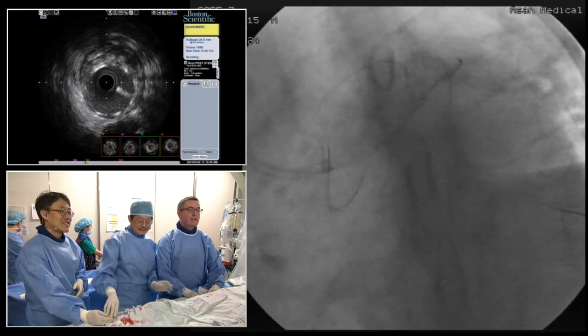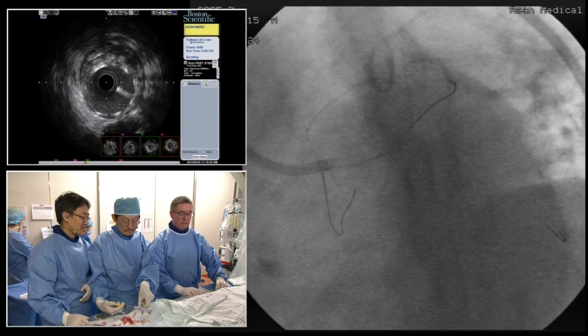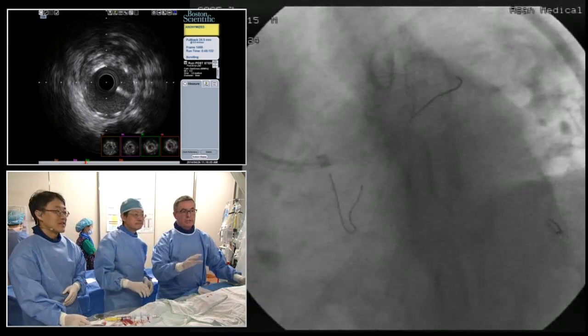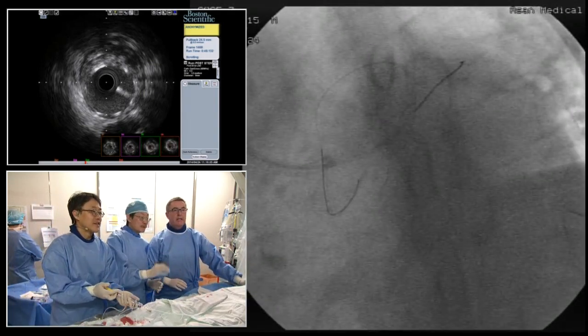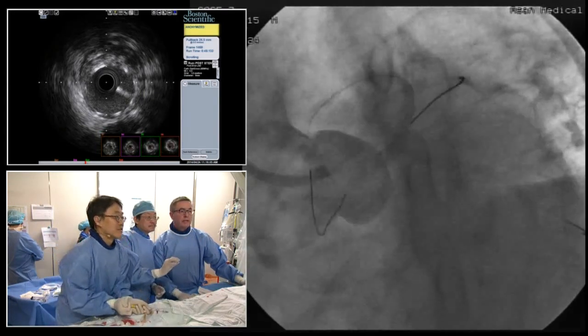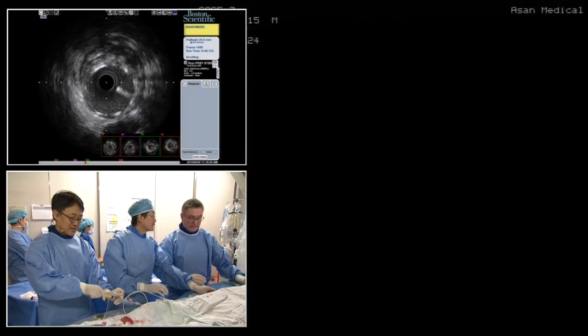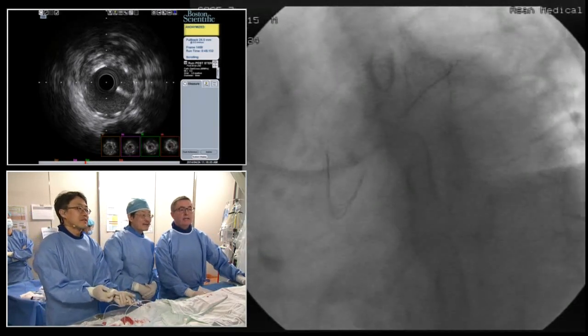So there you go. Now that looks pretty good. Now, again, same deal. We want to just do a shot. Wait a second to see the stents, somewhat close to the left main orifice. And the guide, somewhat. That's okay. I was really only interested in the wire and not the guide.